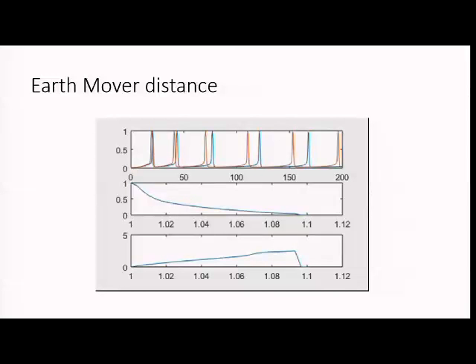But there's another metric called the earth mover distance. Somebody pointed this out to me recently, I fell in love with this tool, haven't really used it yet. But the idea is, if you look at this as a mountain range, you ask how much dirt do you have to move from the blue lines to make it match up to the red lines. You can have a distance on how far you can move the dirt. The further you have to move the dirt, the more cost to do it. There's some really nice optimization algorithms that go and measure how much earth you have to move. You can see down on the bottom there, as we change this, the distance goes up fairly smoothly. This tends to be a much better metric for distance and problems that we see a lot of, especially when you're looking at things like power spectrum where the peak may change in frequency a little bit, which would make the distance really bad if you're using something like a cross correlation.